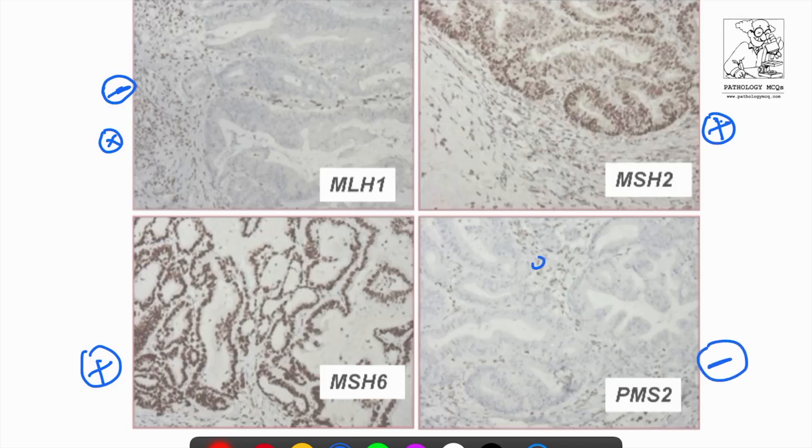This is again positive and PMS2 is negative. You can see in the surrounding stroma, then these cells show positivity. We have to identify the expression in the tumor cells and not the stromal cells. Stromal cells can be used as an internal control. In this case, you can see that MLH1 is negative and PMS2 is negative. So what is the next best step? The next best step is to do a BRAF V600E mutational analysis. This is the next best according to the algorithm we just discussed.